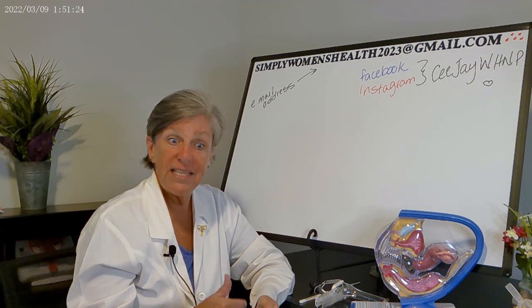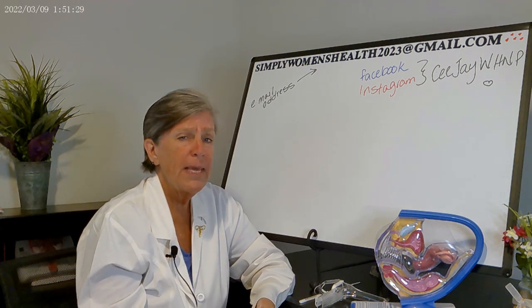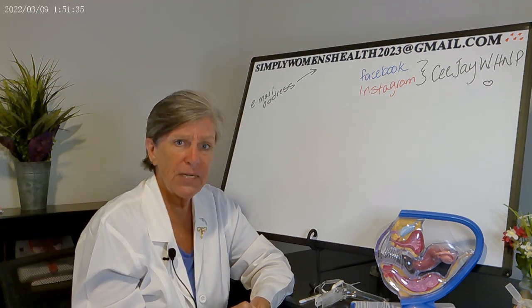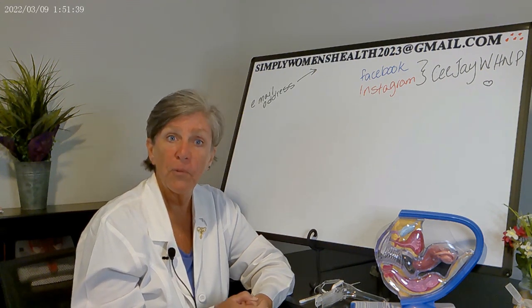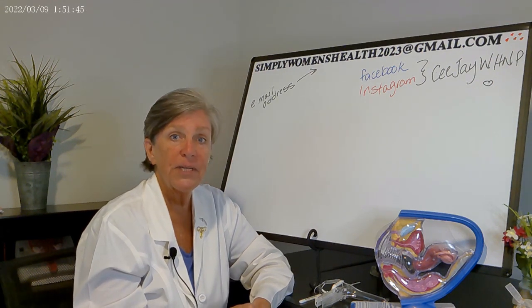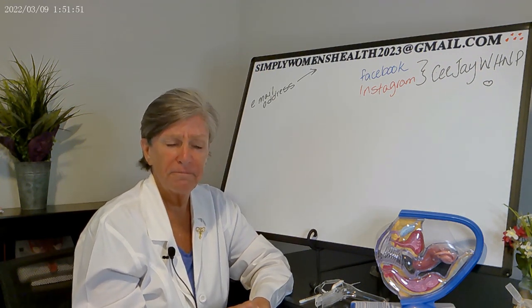Because this device thins out the uterine lining, you can expect unexpected bleeding for about 3 months. After 3 months, the bleeding will calm down. After 6 months, you'll know the full effect of the device. 85% of women report shorter, lighter, or even absent menstrual cycles with both Mirena as well as Kyleena. A small percentage of women will have increased acne, a small percent will have increased depression symptoms, and a small percent will have ovarian cysts. These are just things that you need to be aware of.